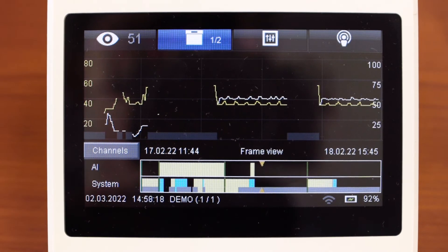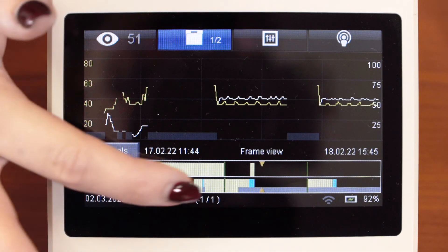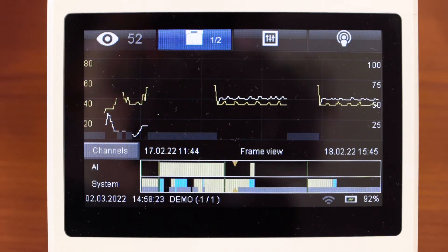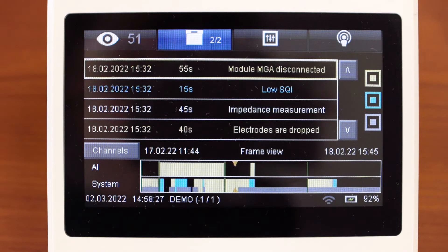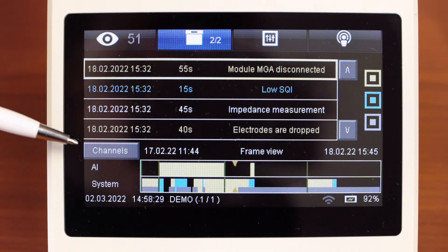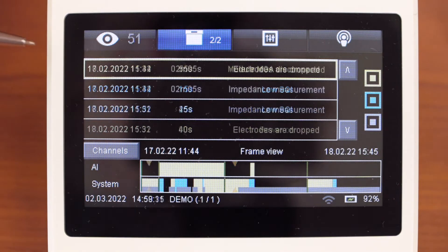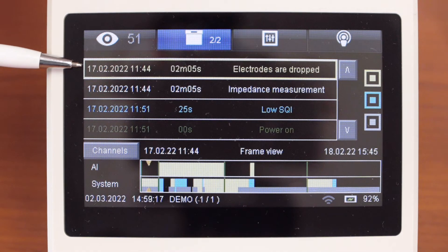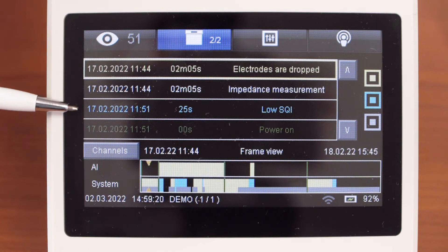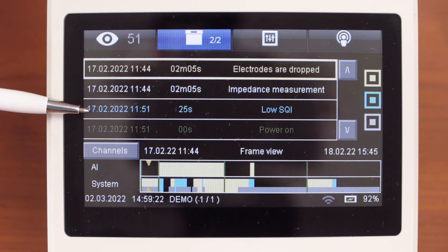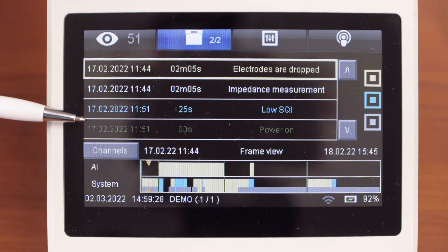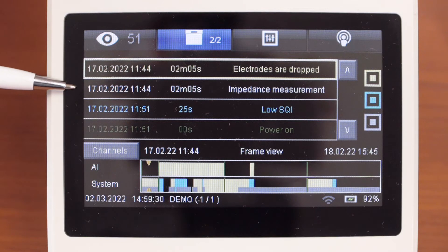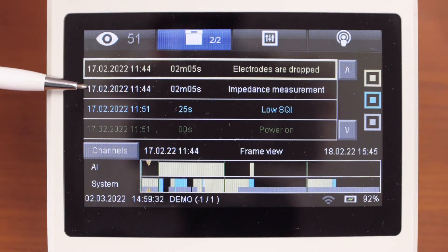You can choose the moment of time and press trend button again. So you can see the alarm. Yellow color means medium priority. Blue color means low priority. Green color means the turn on event. White color means the technical event.